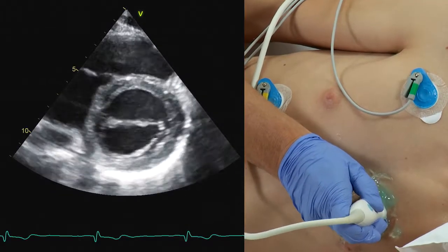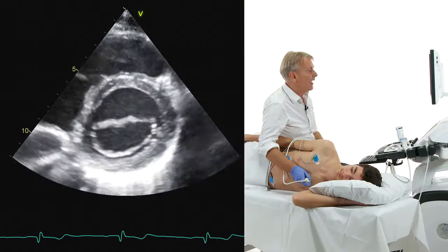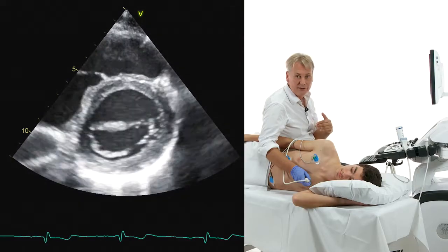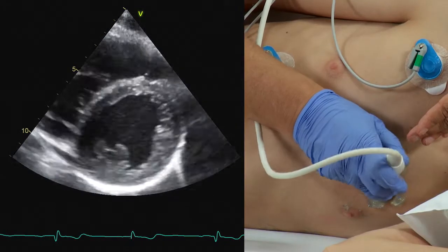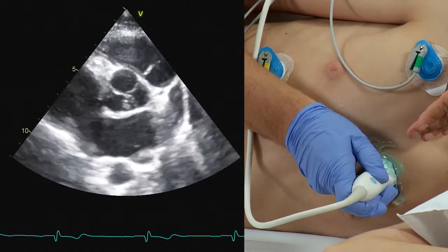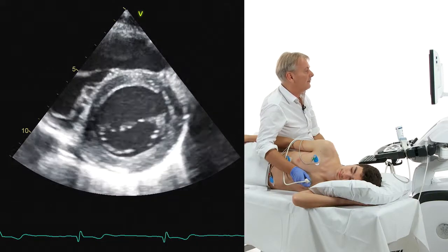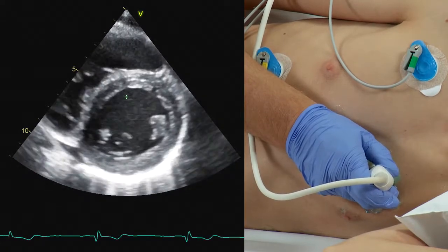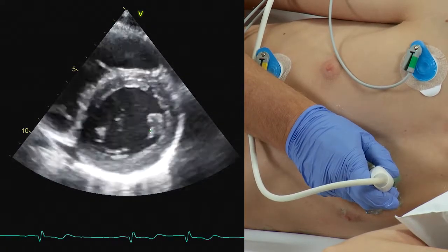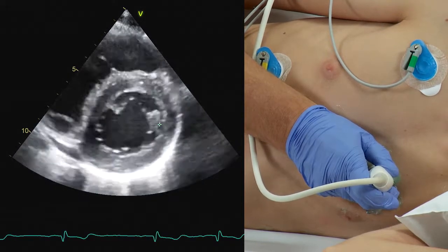We are here now at the level of the mitral valve in a short axis view, and now trying to stay perpendicular to the axis of the heart, which runs something like this. You will tilt the transducer downwards and upwards and thereby scan the entire ventricle. Let's start at the mitral valve and move downwards. You see the left ventricle is obviously a circular structure with the right ventricle right here. This is the papillary muscle.